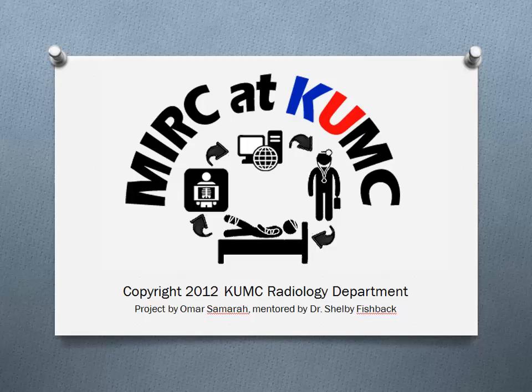Welcome to Getting Started. Several things must be accomplished before you can begin authoring your teaching files. You must have a computer capable of running the required software, login credentials, and materials with which to construct a case. The goals of this tutorial are to install the required software, obtain the credentials required for access, and know the materials needed to construct a case.